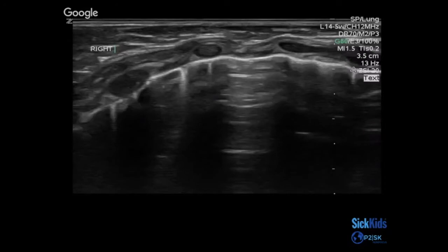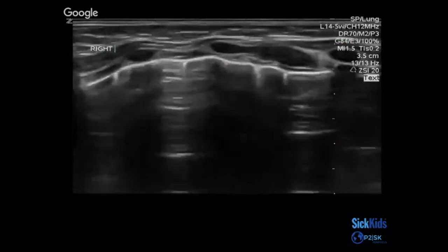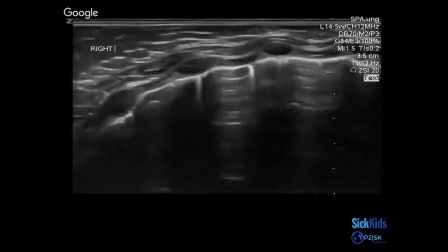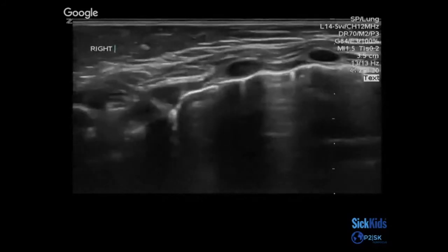So you decide to scan her lungs. And let's review a range of possible POCUS findings. So in scenario 1, this is what you see. And we don't have any trainees here today, but how would you describe the findings in this?